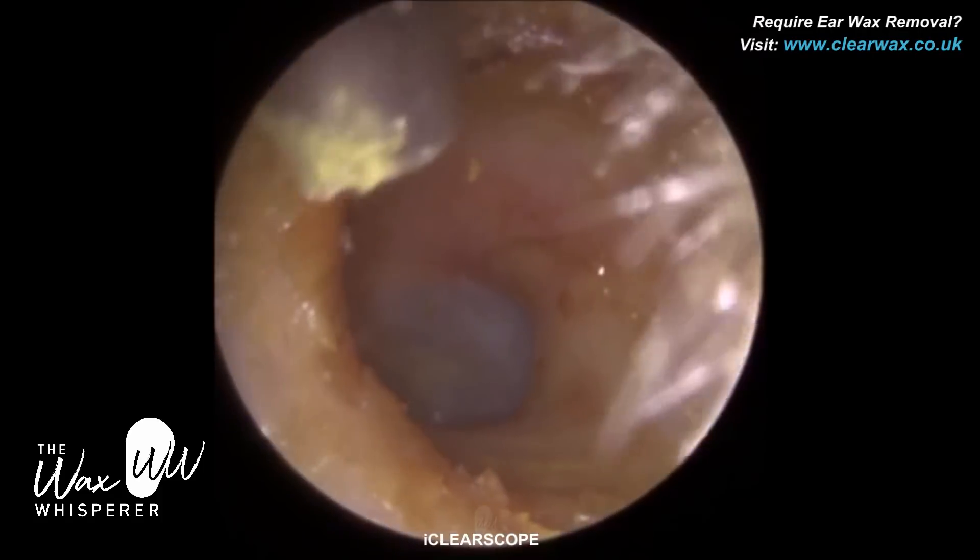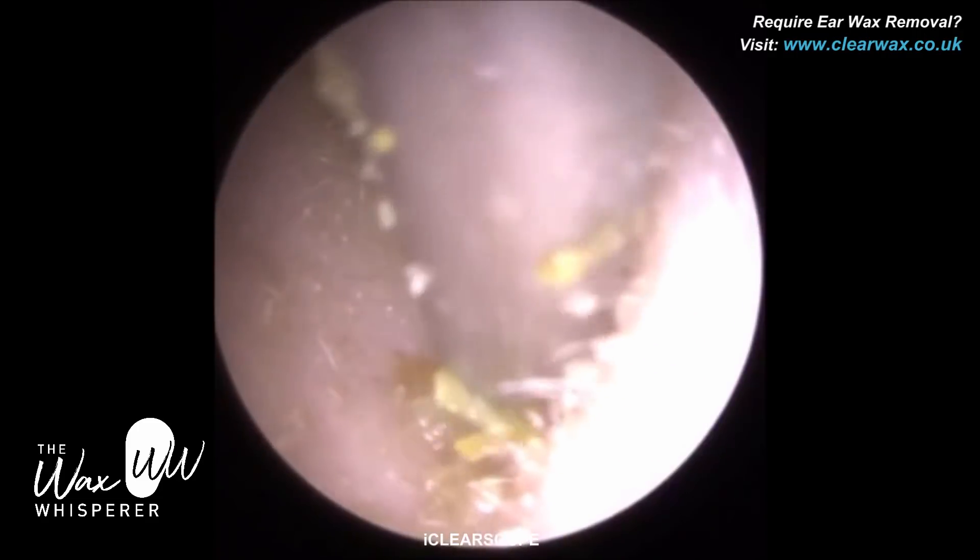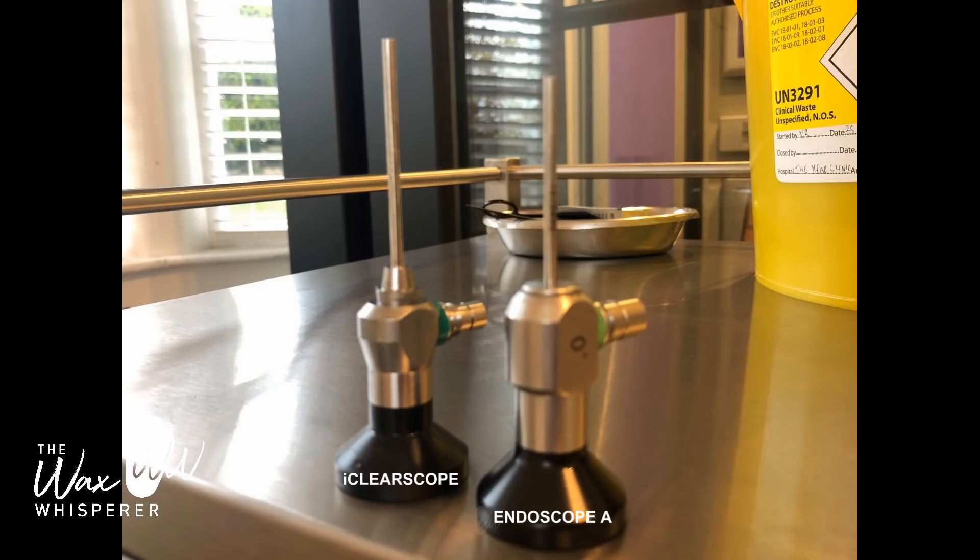You get a lot of other endoscopes that are CE marked, but the iClearScope is CE marked specifically for the purpose of earwax removal. Here's a side-by-side image: Endoscope A is on the right-hand side — you can see it's shorter in length — and the iClearScope is to the left, where you can see the working length is a lot longer. I hope you enjoyed that video and found it informative. Take care, bye.